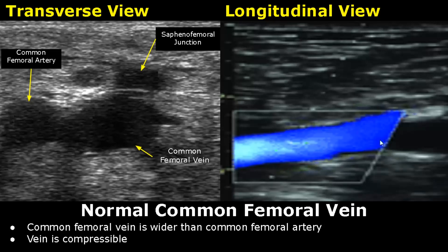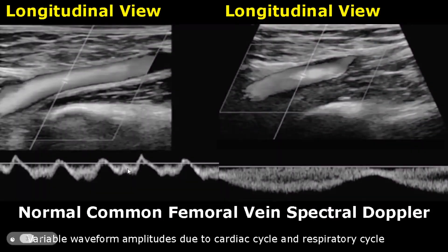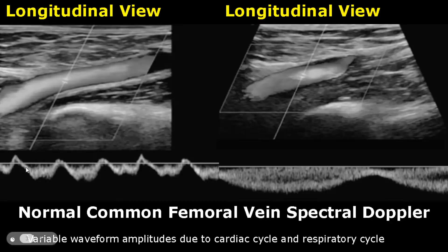Here is a longitudinal view of the common femoral vein with color Doppler. The blood is flowing towards the heart. The spectral Doppler waveform of the common femoral vein is variable. These variations are due to the cardiac cycle and the respiratory cycle. Normally we will see these types of waveforms.